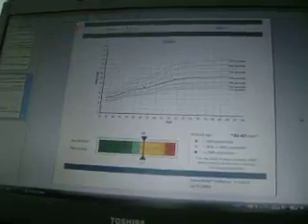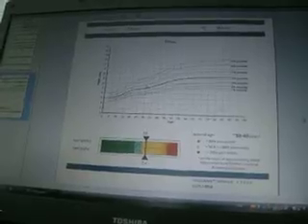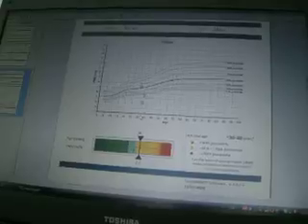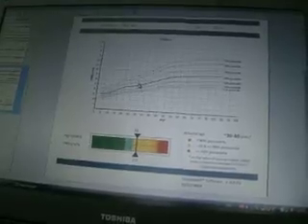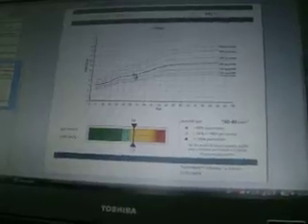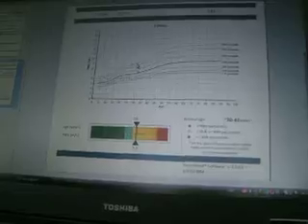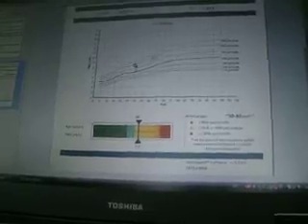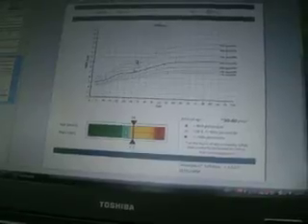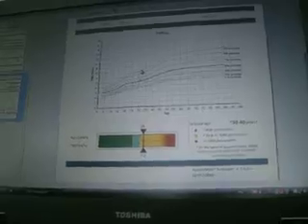So this is a reference chart based on European population, which shows that according to her age, this patient is right at the average regarding the pulse-wave velocity, so she is quite in a fine status now. Should she be above the 90th percentile, that would mean that she is in the extreme upper 10% of her age, meaning that she is in a high-risk mode.